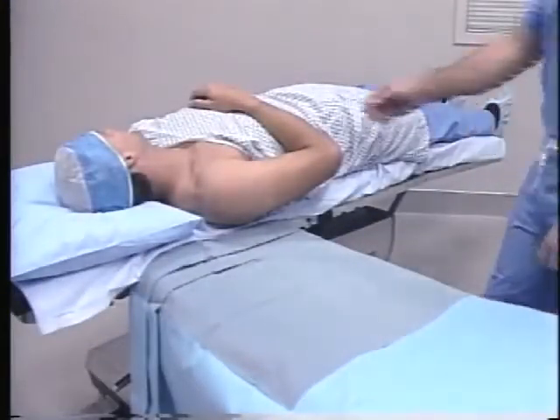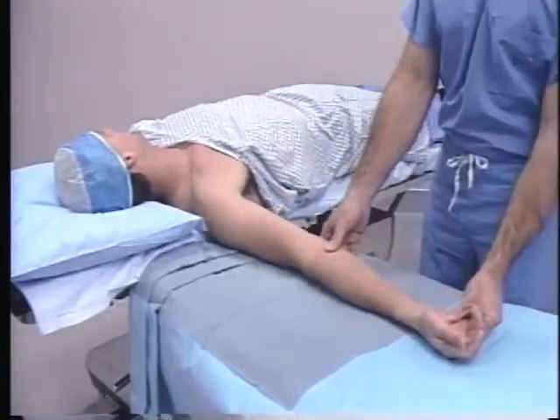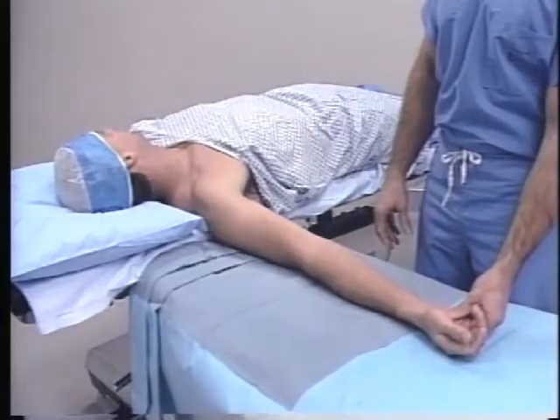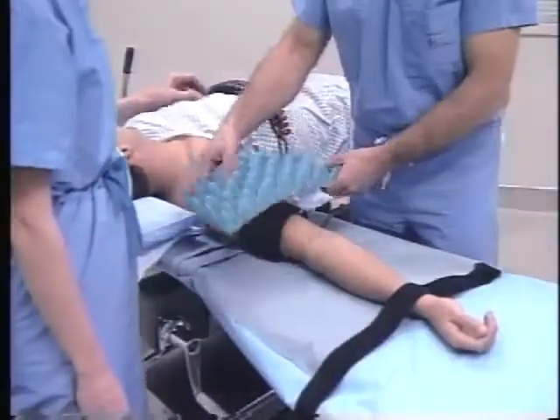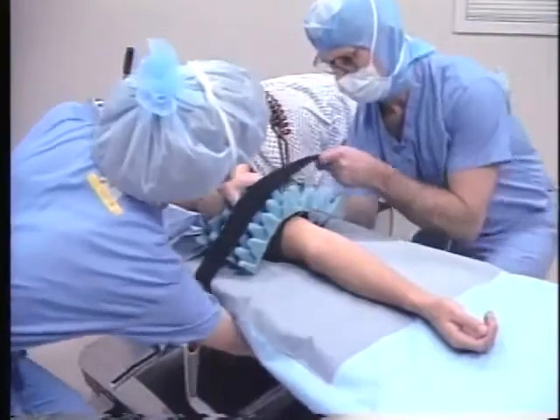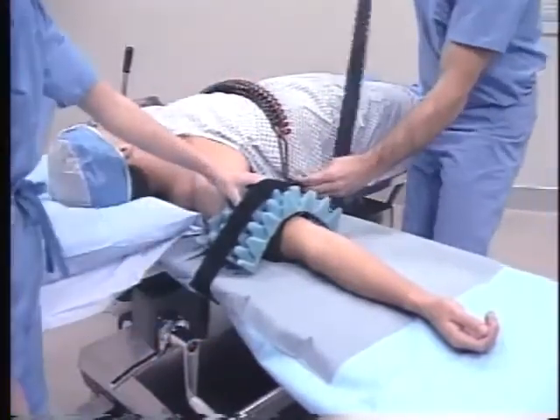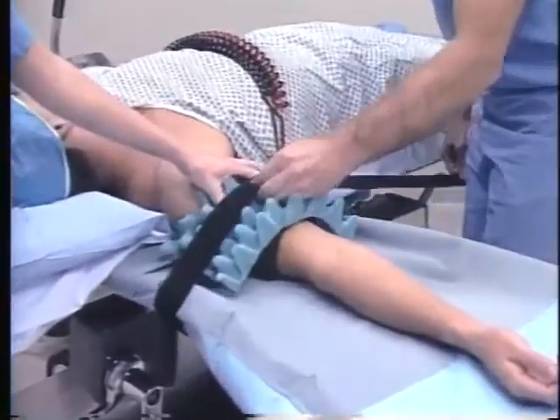Proper setup of the Traction Tower requires the use of a draped arm board or hand table. The patient is placed in a supine position with the operative arm placed on the hand table. The tourniquet cuff is put into place. An egg crate foam is used to cover the tourniquet cuff. The upper arm strap is then draped over the foam padding. The strap is passed under the hand table and tightened, supplying a source of counter traction.